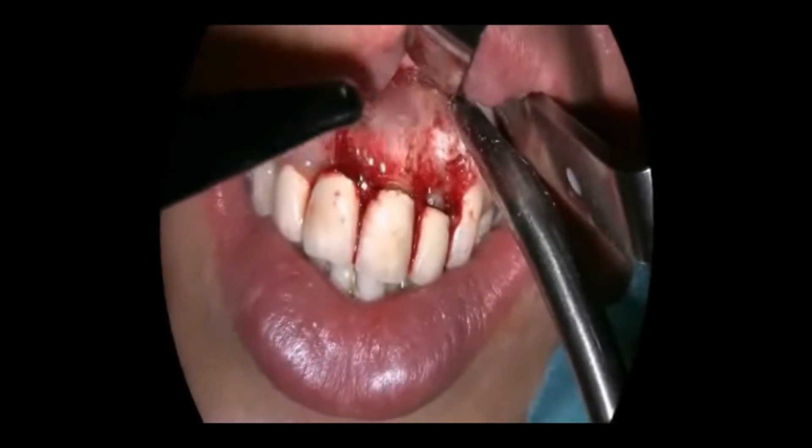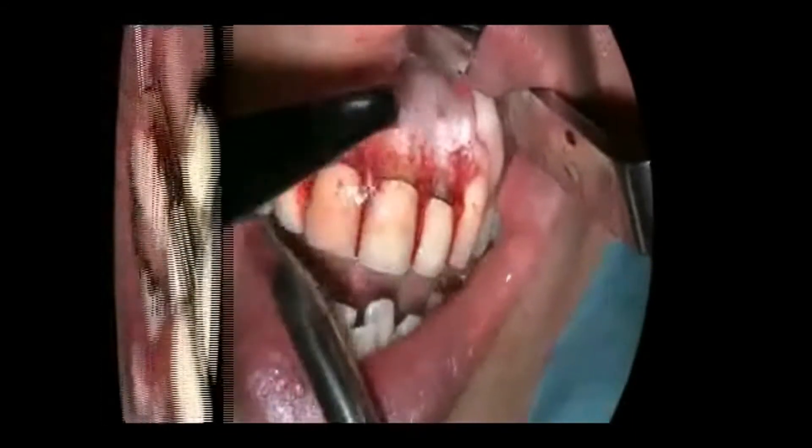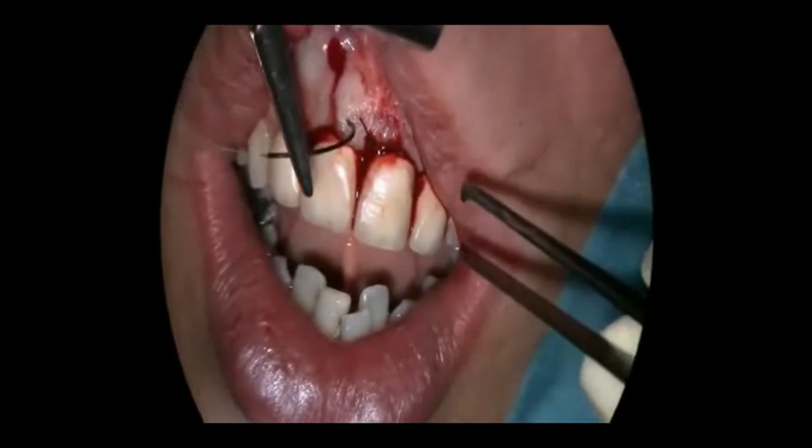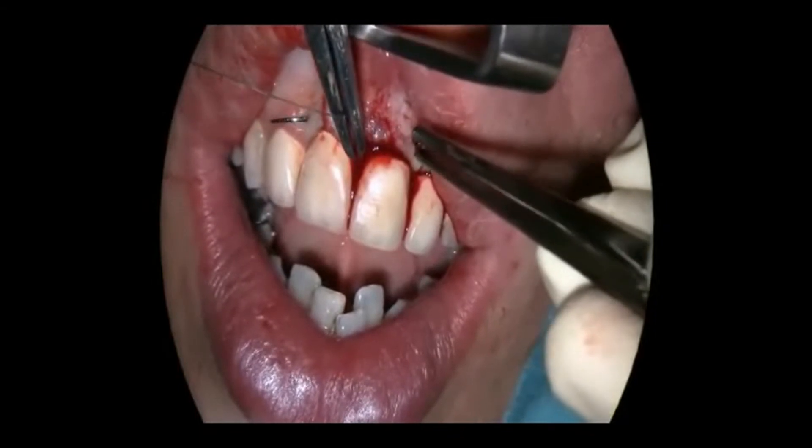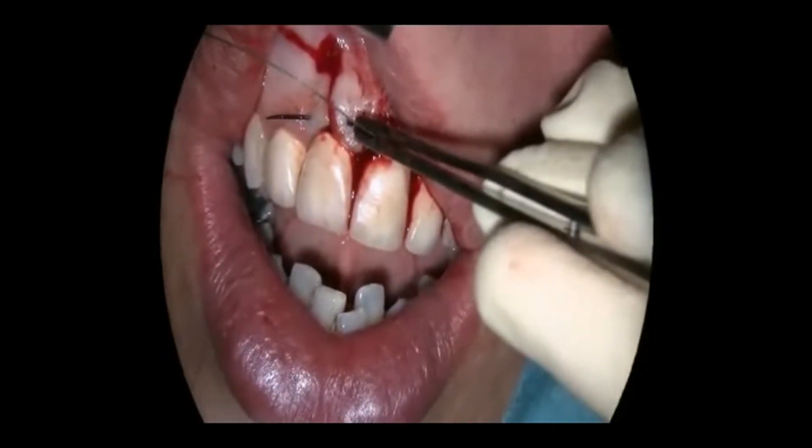In about a year, new bone should form around the root tip. This process is monitored with x-rays. Lastly, the wound is sutured. This procedure is root tip resection with retrograde filling.